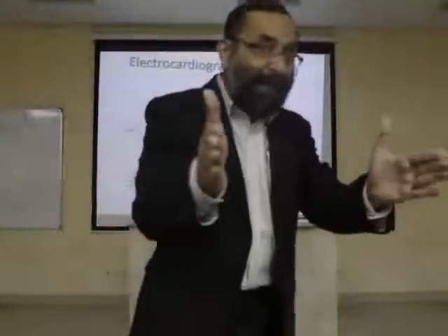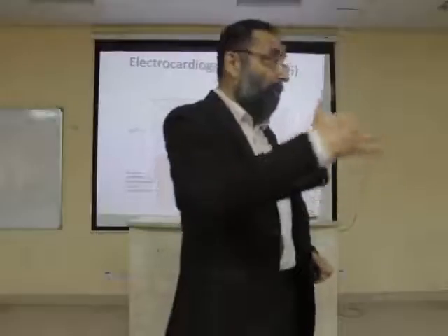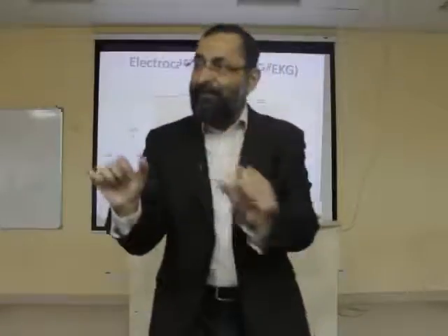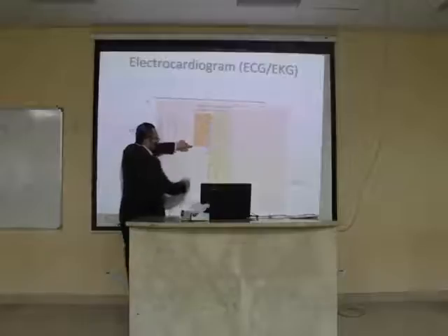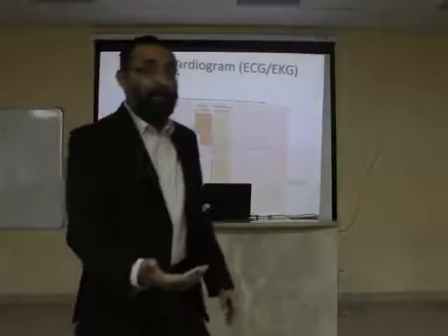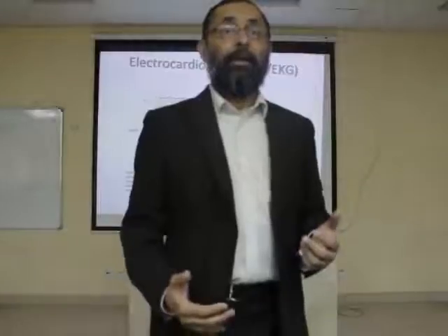Combine the wave and the segment to get further clinical interpretation. If you want to understand clinical interpretation, we need to combine the waves and the segment. I am combining the P wave and the PQ or the PR segment, and I will call it an interval. What do I call it? Interval.